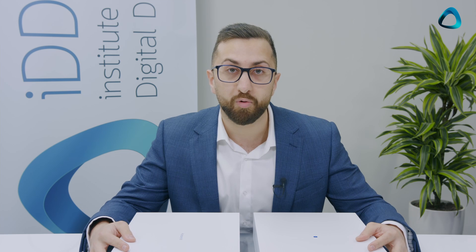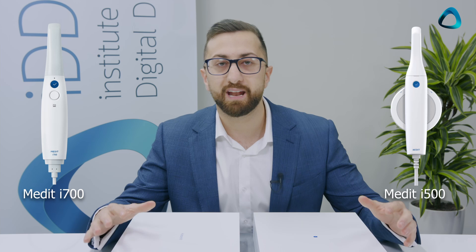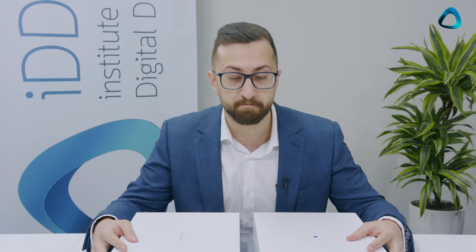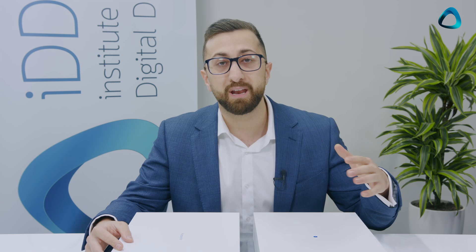For those who don't know, the Medit i700 is the successor to the Medit i500 — a scanner that really shook the industry for two main reasons. First, it had a really low entry cost: at $18,000 USD at the time, it was much cheaper than many other intraoral scanners on the market. And second, it had no subscription fees or yearly fees at all, which made it even more attractive.